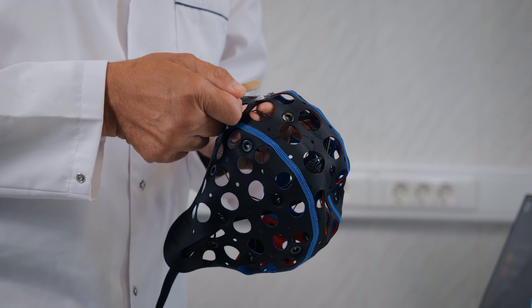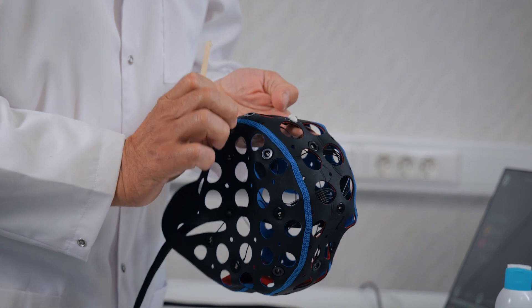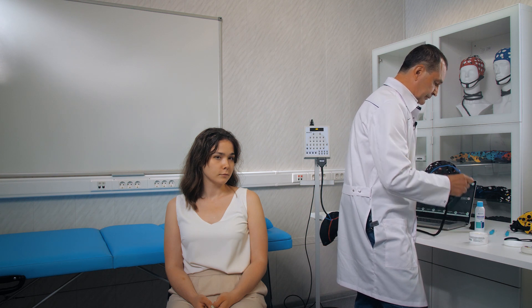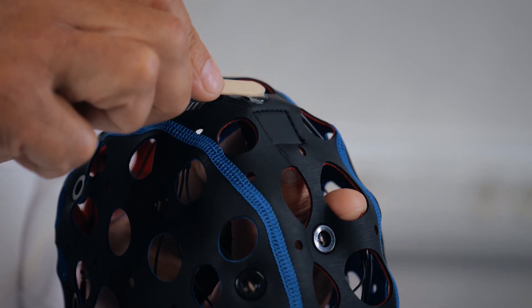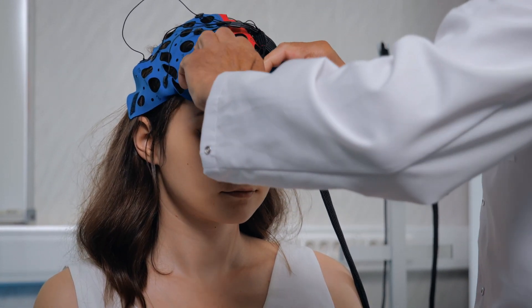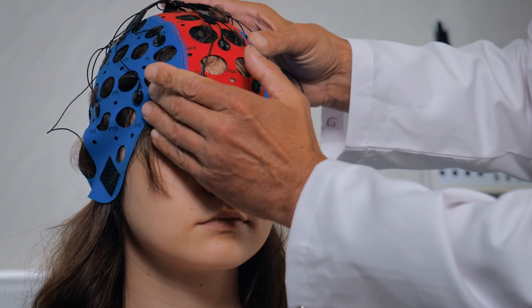We fill the sagittal line first, then the parasagittal, then the temporal, in a particular order so as not to miss any electrodes and to ensure we stay on track. We have successfully filled all the electrodes with paste and are now meticulously placing the cap on the head of the patient in order to conduct the experiment and gather accurate data. We secure all the small electrodes tightly.